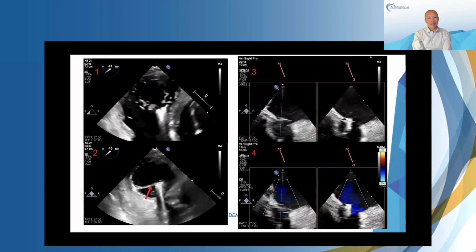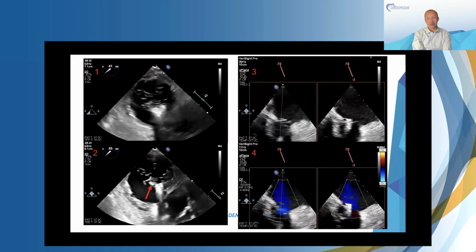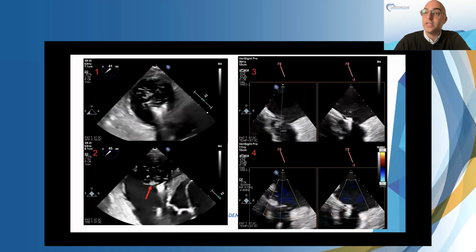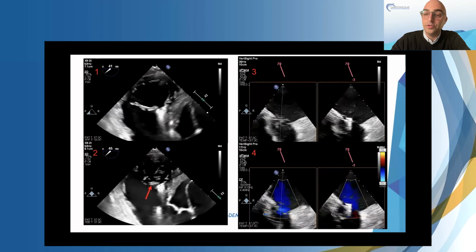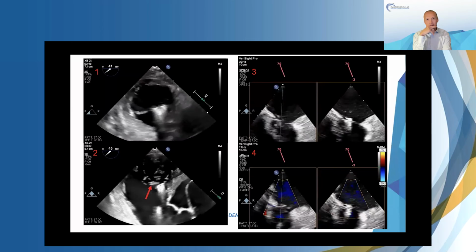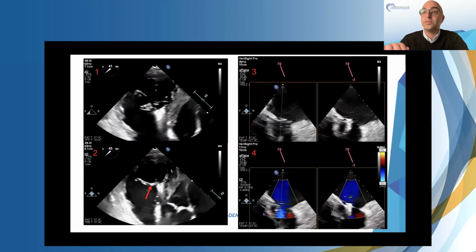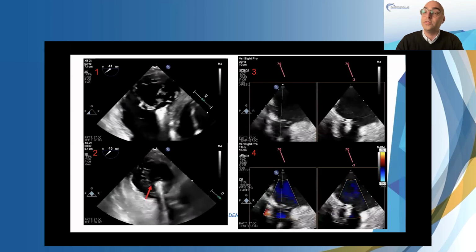Can I just ask about the tilt angle? How do you know which way to go? Are you just trial and error? Because here it's -3. I saw it was 5 a minute ago, or 2. So, Paul, what I noticed, and Gagan knows this, is those 1 or 2 degrees on that tilt elevation make a huge difference. And Gagan, you've seen this because you work with other imagers in our group who use tilt elevation with ICE. I sometimes will check, because my worry is if the catheter moved at all in any way, then it's going to be a little bit different. So you'll see it's -3, then -5, because nothing ever stays still. And even 1 degree makes a difference, or 2 degrees is what I've noticed.